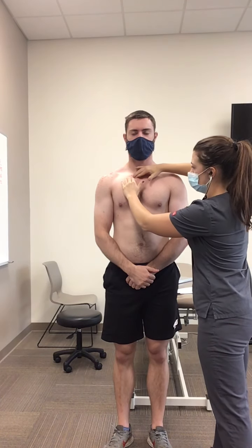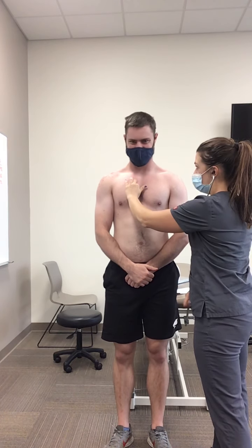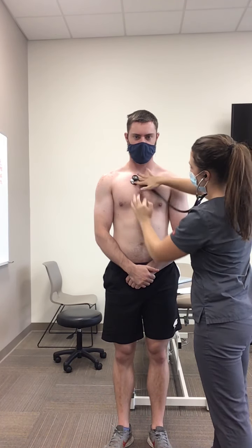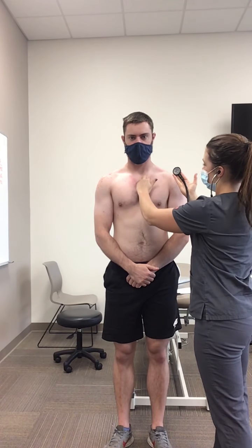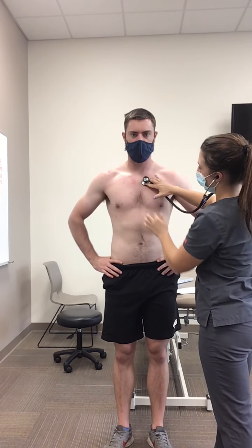The first thing I'm going to do is find the patient's second right intercostal space — coming just underneath their clavicle, first intercostal space, second intercostal space. Once I find that, just lateral to the sternum, I'm going to cue the patient to breathe normally. Then I'm going to come just lateral to the second intercostal space on the patient's left side — that was for the aortic valve, and this will be for the pulmonary valve.